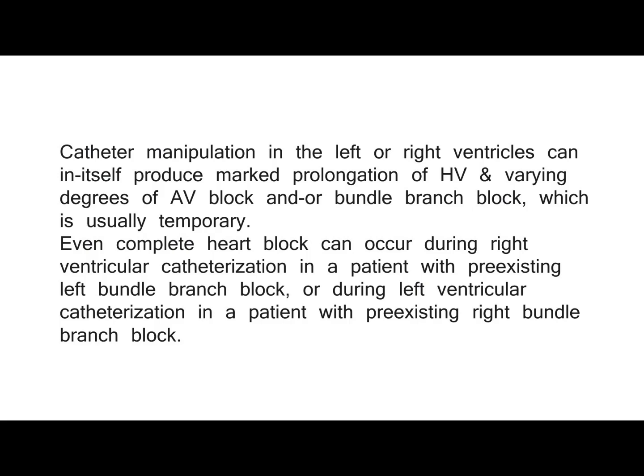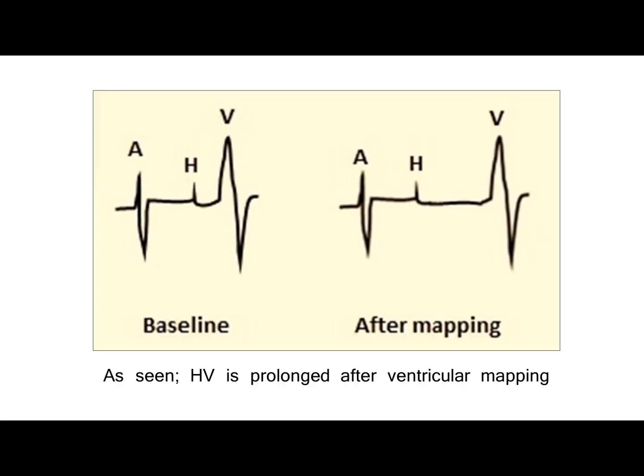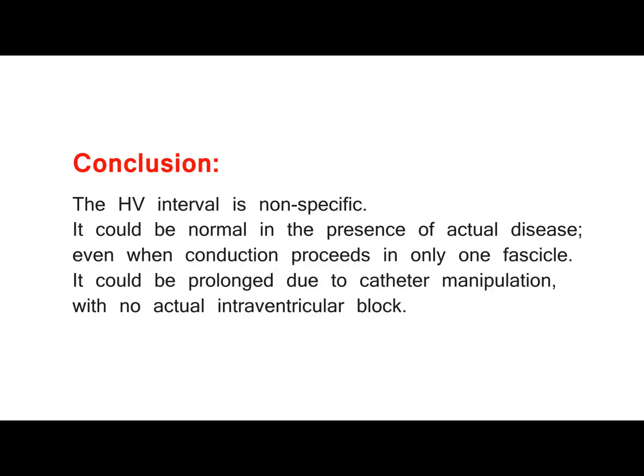Even complete heart block can occur during right ventricular catheterization in a patient with pre-existing left bundle branch block, or during left ventricular catheterization in a patient with pre-existing right bundle branch block. As seen, HV is prolonged after ventricular mapping. Conclusion: the HV interval is nonspecific.